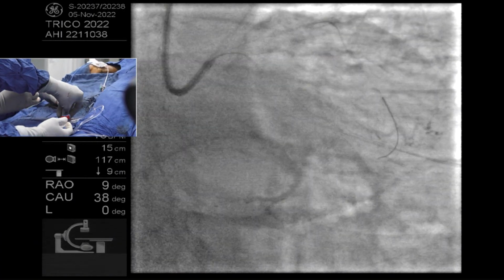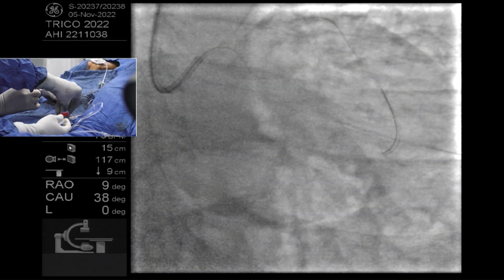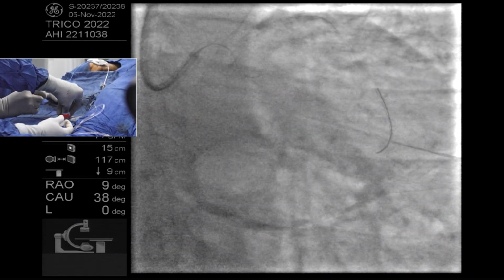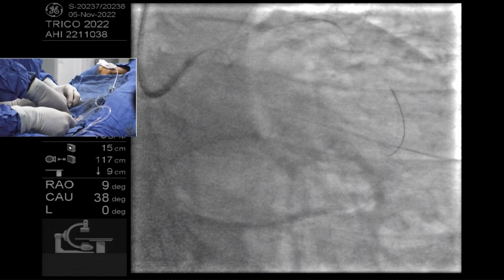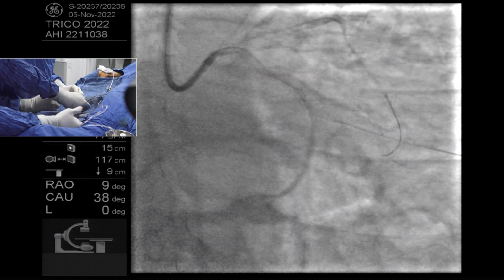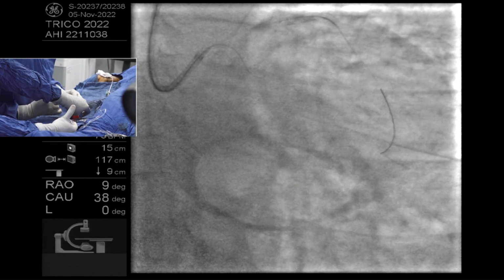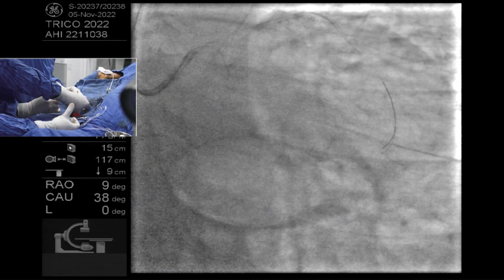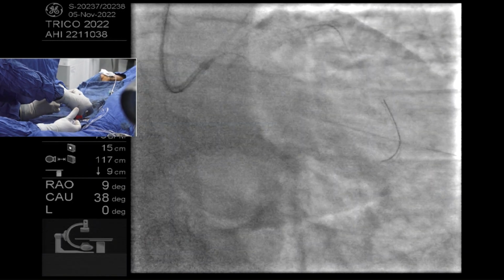It's very difficult. Difficult. All the difficult jobs will be done by you and it is easy for you. So we don't have a double lumen catheter? No, we don't have.